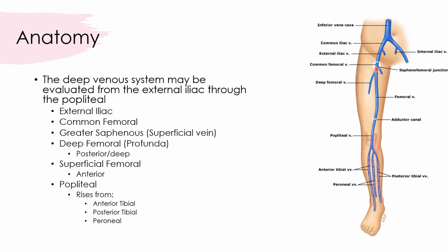to be found going down the medial thigh all the way until it dives through the adductor canal. This is going to occur at the medial leg about 4 inches above the knee. Once it does this, your ability to follow that vein from the medial thigh gets very challenging.